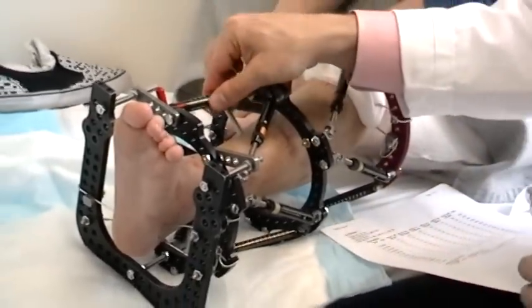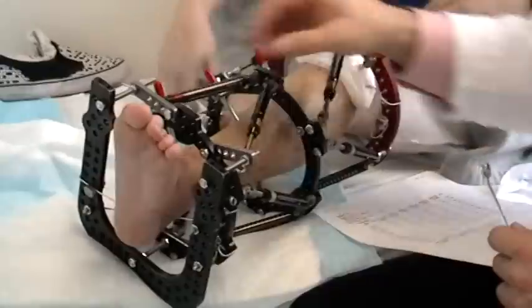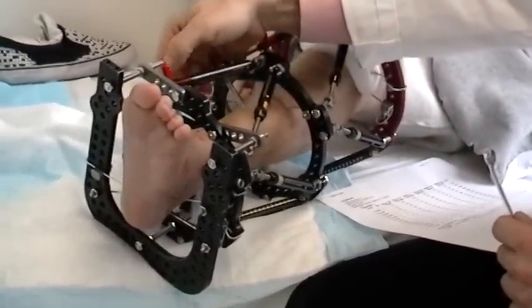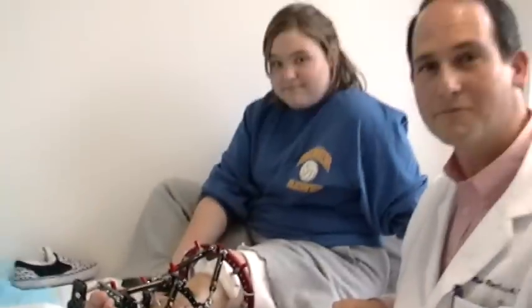Since we weren't really supposed to do that adjustment, let's move that one back. We're just going to go in the opposite direction and move it back to 116. And that's about it. Thank you.